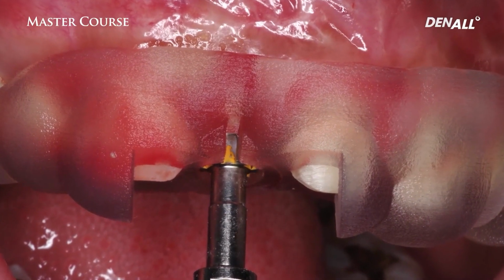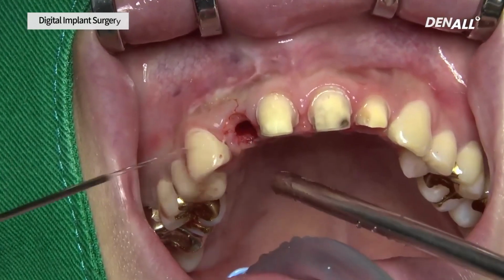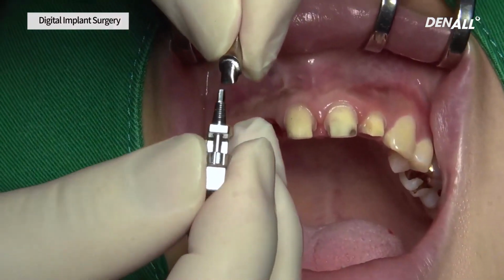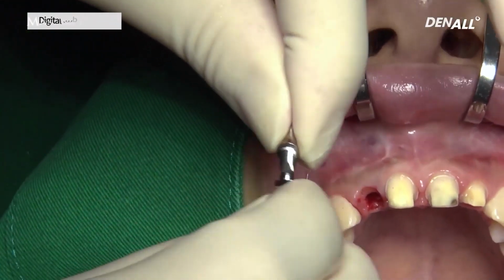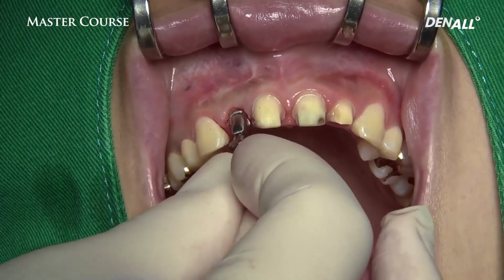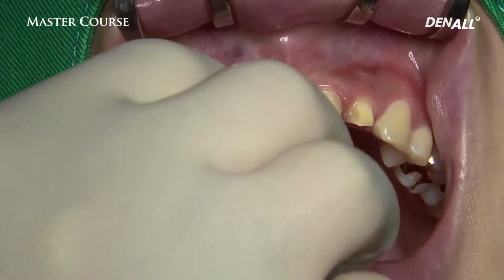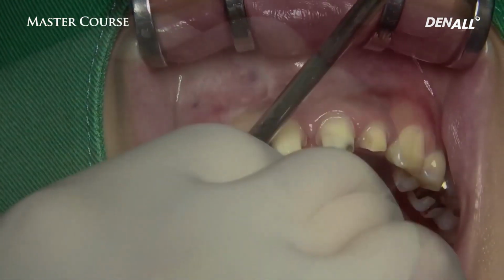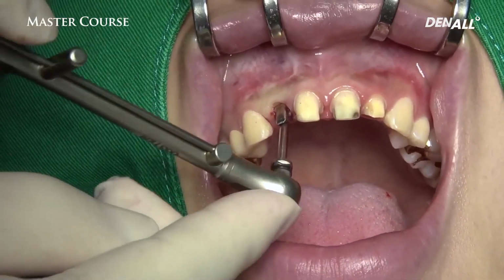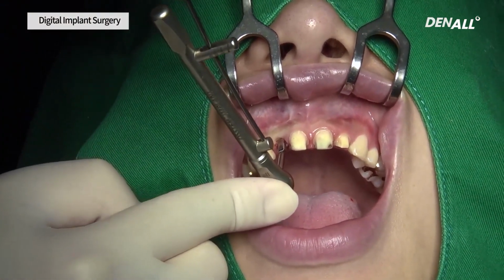That is very important. In this case, before implant placement, in advance, the customized titanium abutment, that is the Osstem one-piece abutment, and temporaries were fabricated. A hex type titanium customized abutment is prepared, so the hex positioning is very important when it comes to the internal connection type. When the abutment is accurately connected, the subgingival critical contour of the abutment presses down the marginal gingiva appropriately, automatically performing the tissue molding.